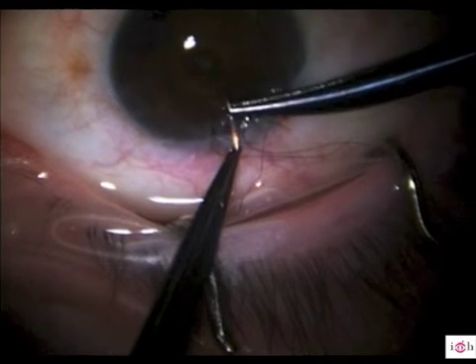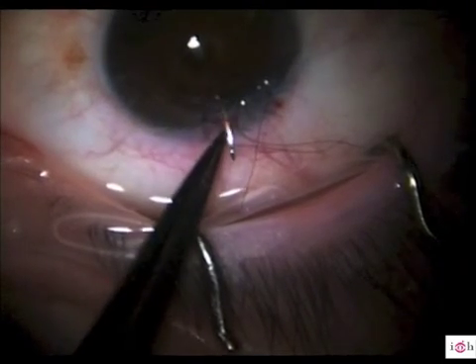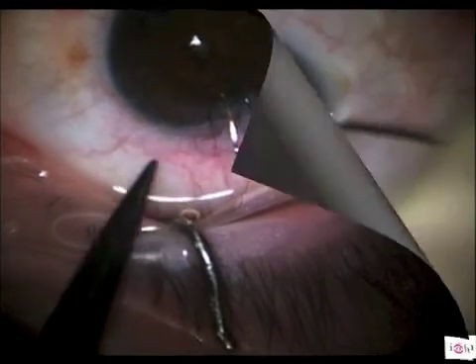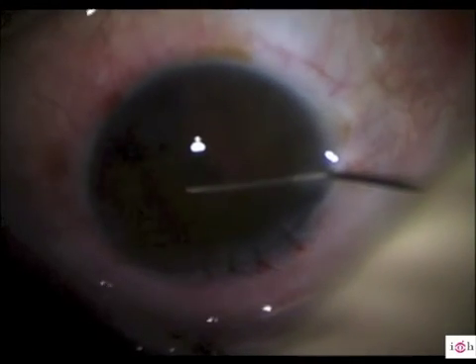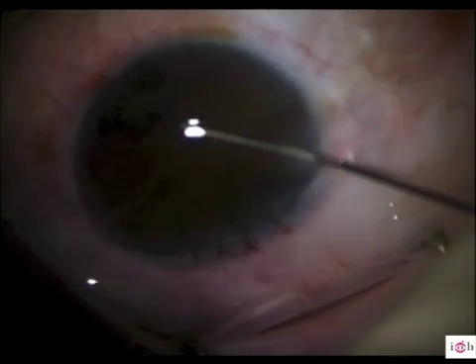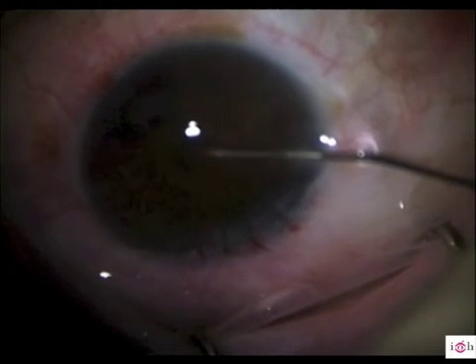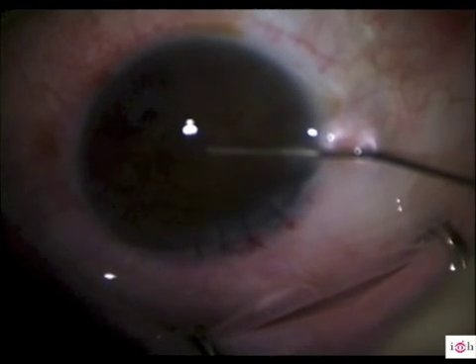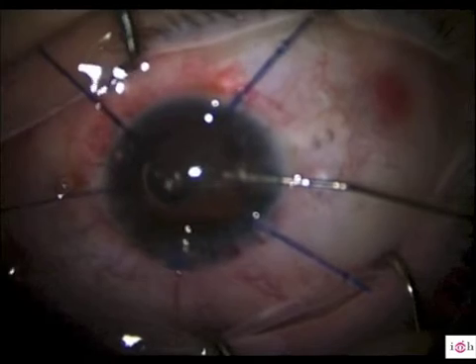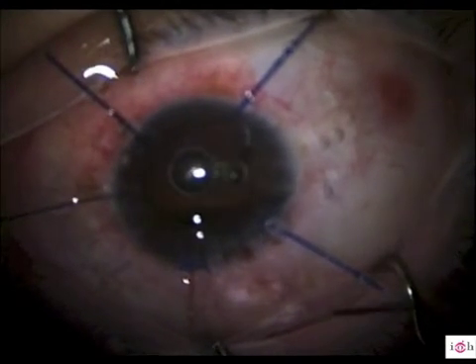After removing the IOL, we sutured the incision to continue with the phaco surgery with a closed anterior chamber. The cornea was losing its transparency during the surgery, and at that point visualization was very difficult. With viscoelastic, we opened the pupil at one small point. Then, with the spatula, we managed to release the pupil completely.